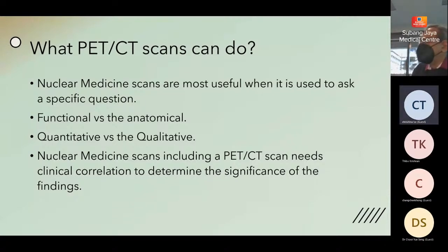The history is important. I don't expect the doctors to write the entire clinical history of the patient in our request form, and that's why sometimes I have to ask for your forgiveness that we give all kinds of potential possibilities. The patient has got past history of malignancy, this could be this. The patient has got constipation and all. The spot that we see in the bowel may not be physiological, could be a colonic neoplasm. So the differential is a lot. So you need to call it.